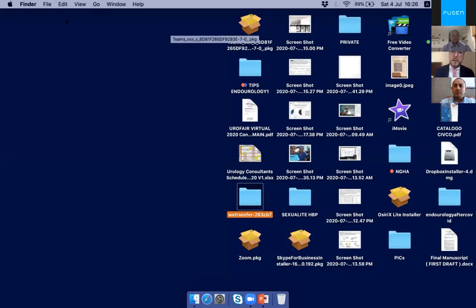Professor Shi, this is the last poll that we will show you. Look at this. In your clinical practice, which solution for lithiasis will you use frequently? You can see that only 48% are using flexible ureteroscope, and only 5% using SWL. And we know that SWL is a very common procedure in the Middle East. How come our audience no longer uses SWL? Do you think SWL will fade out?